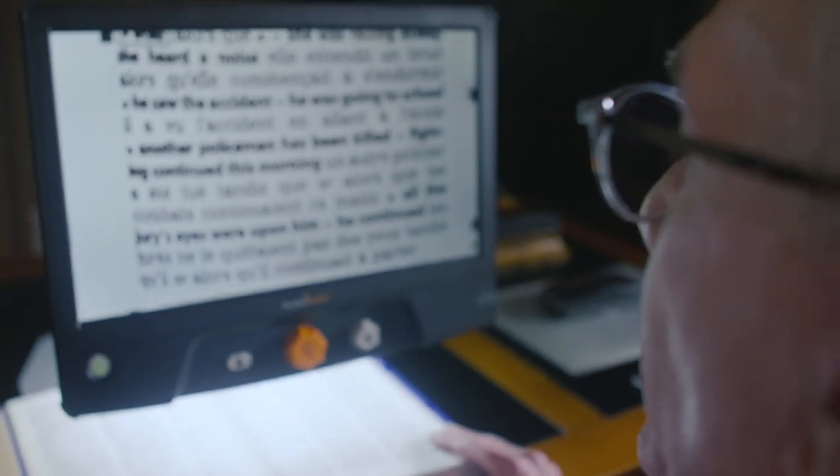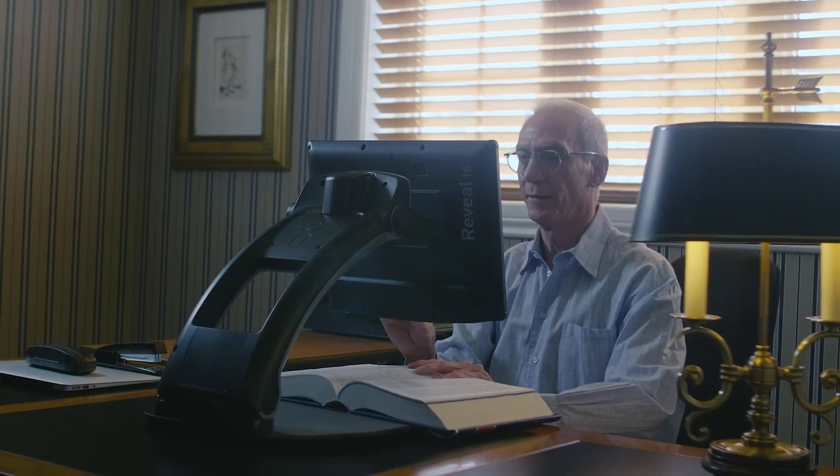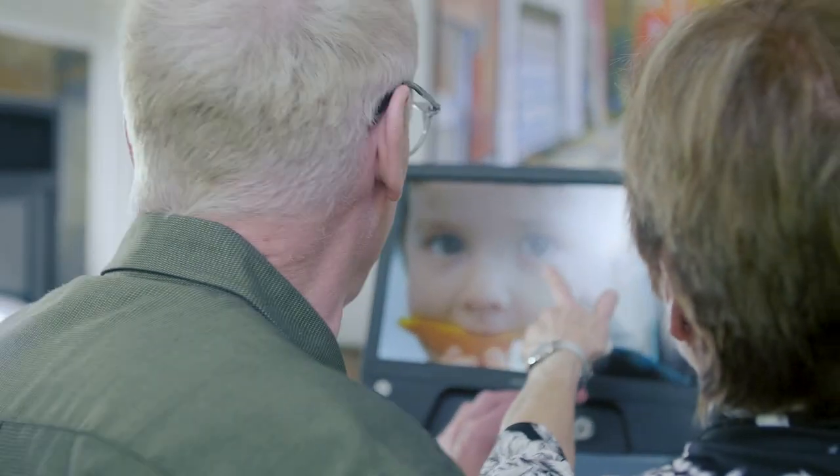Featuring an adjustable 16-inch screen, the Reveal 16 is the perfect device for reading your favorite books. Relive your unforgettable memories. You can browse your family photo album and enjoy every little detail thanks to the different magnification levels that the Reveal 16 offers.